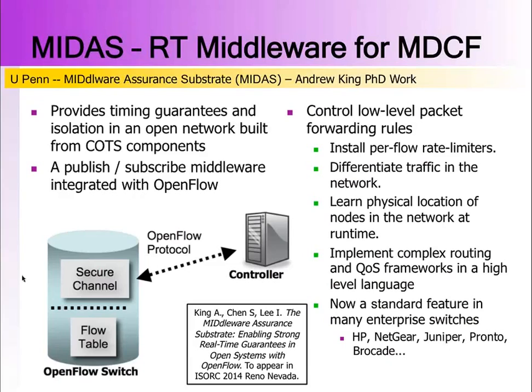And now these are provided by a number of vendors, so if you want to run this type of system in a hospital, the idea is that you should just be able to go into the hospital's networking cabinets, which also include these switches that can support this protocol, and just change to run the OpenFlow protocol.